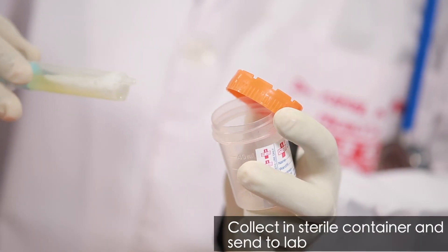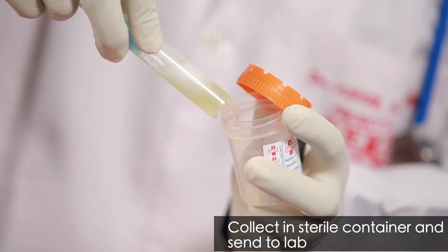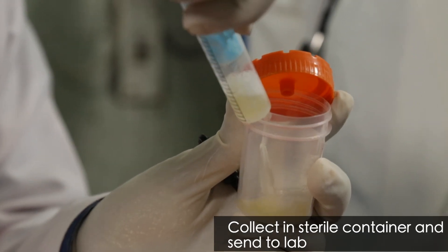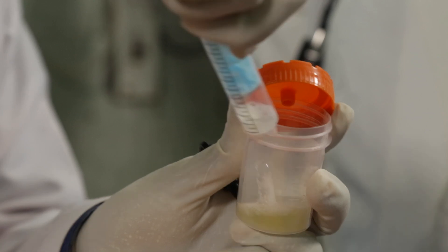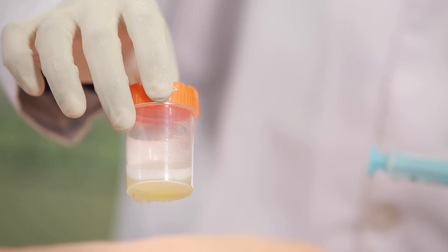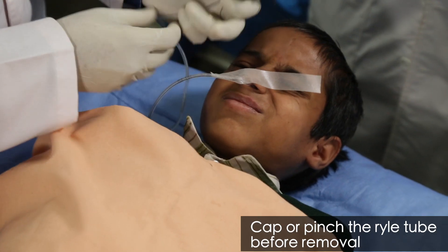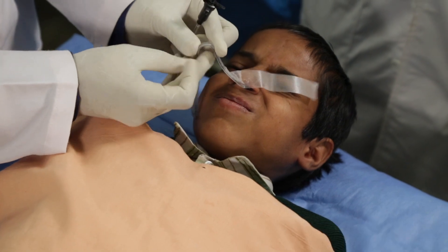Collect the aspirate in a sterile container. A specimen is considered adequate if it contains about 10 to 15 ml of stomach contents. After collection of the gastric aspirate, gently remove the tube by closing its cap or pinching the tube.